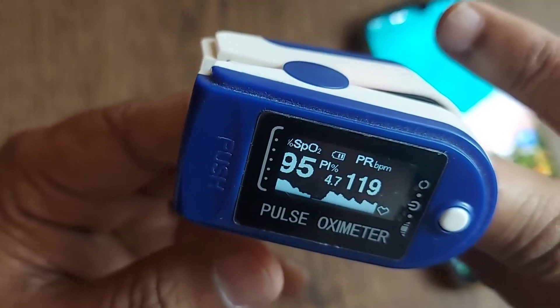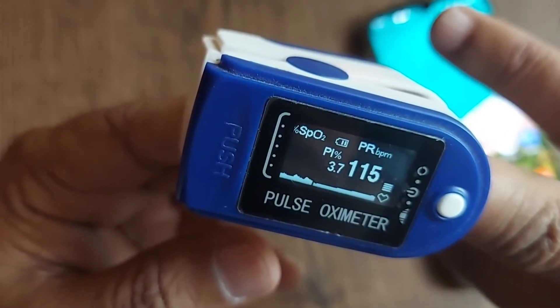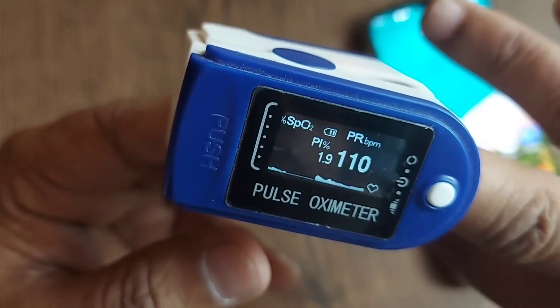SpO2 should be basically more than 95. In this case, mine is measured as 97 — pretty good. If it is less than 94, we have to contact our family doctor.